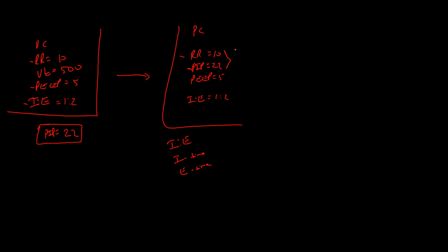You're completely right. If you have high CO2s, you need to either, back to Kevin's golden rules, increase minute ventilation. And you do that by increasing respiratory rate or increasing tidal volume, or both. Both of those have the effect on the minute ventilation.